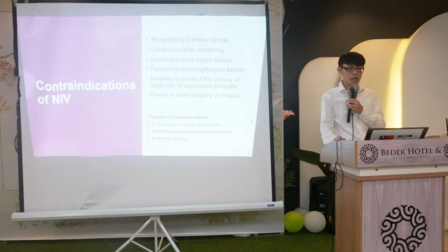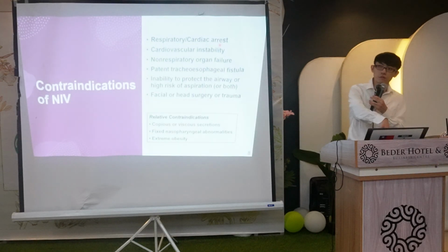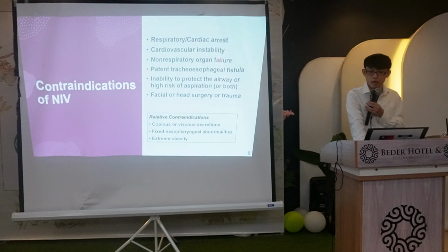Okay, the contraindications of using NIV include conditions related to more severe cases, which means the patient is required to use endotracheal intubation and invasive mechanical ventilation. So, like respiratory or cardiac arrest, hemodynamic instability, and or multiple organ failure.